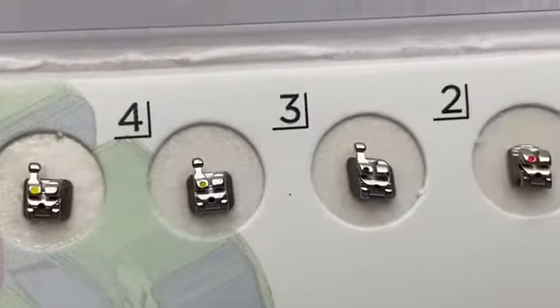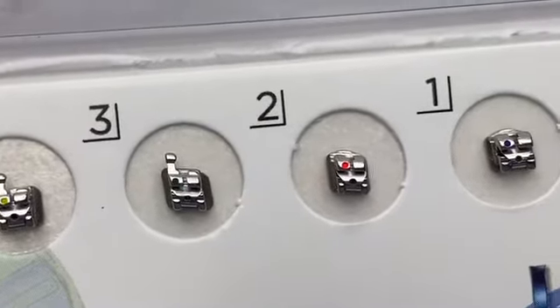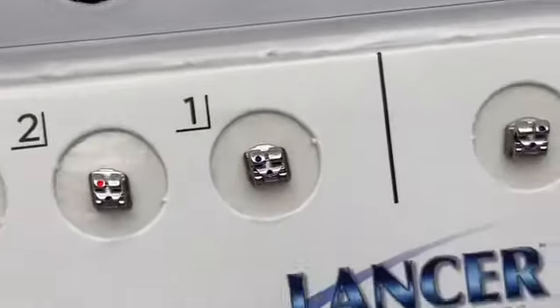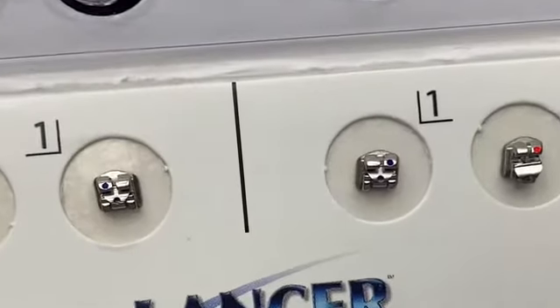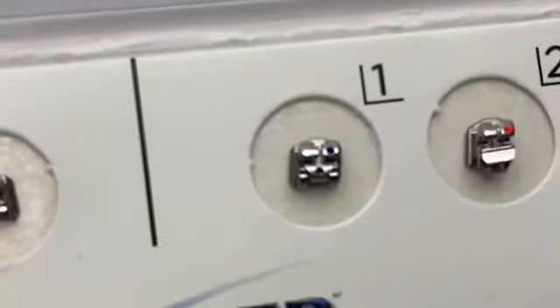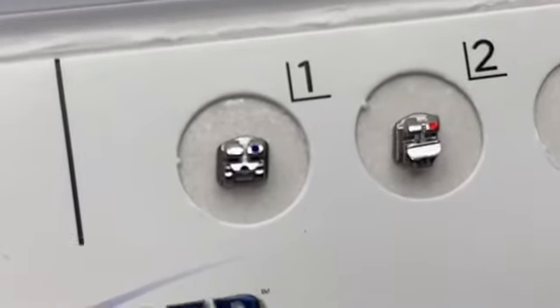Here's number 4, or 3. Number 2. You see the central incisor, lateral incisor — I mean canine right here, and lateral incisor here. And here is the central incisor again. It's pretty cool. You see that little tiny hole there — that's where you basically lift it up.